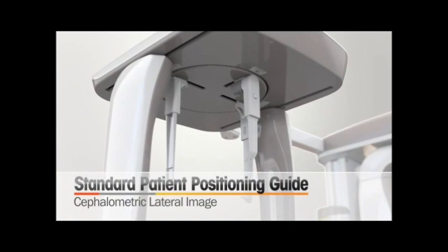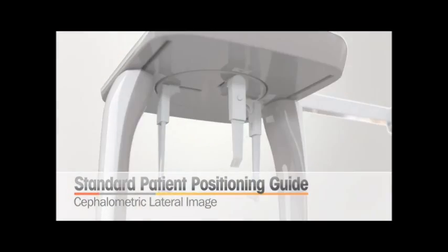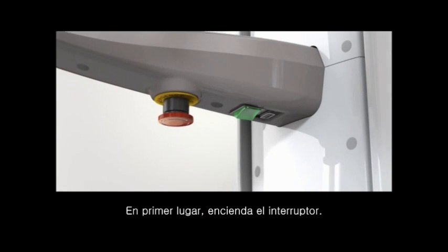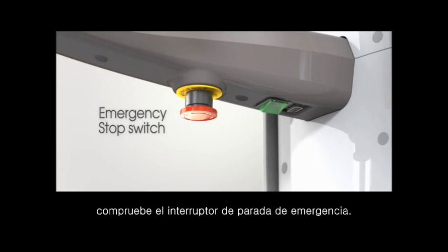Now, we start the standard patient positioning guide for cephalometric lateral image. First, please turn on the switch. If the machine is not working, although the switch is on, please check the emergency shutdown switch.